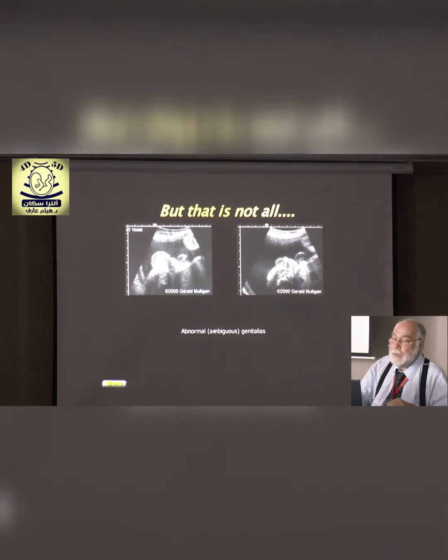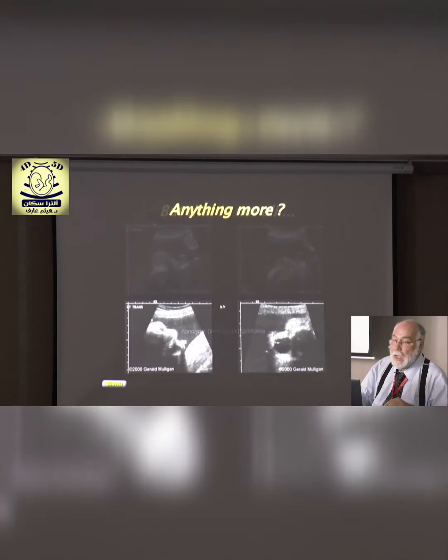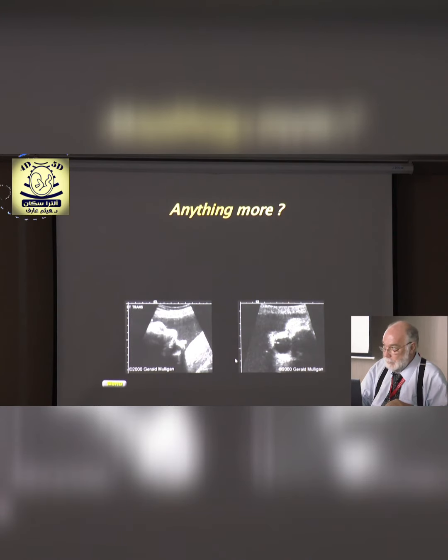But remember, this baby has ambiguous genitalia. Does a cardiac surgeon care about ambiguous genitalia? Probably not, huh? This is not his part of the body. What is this here? The eyes. What's wrong with the eyes?